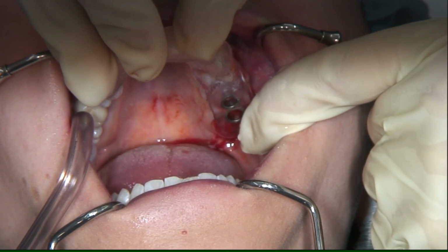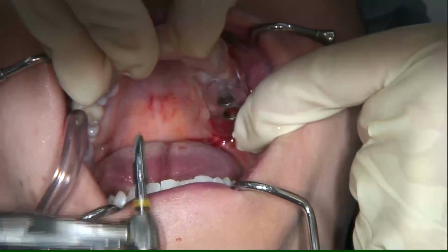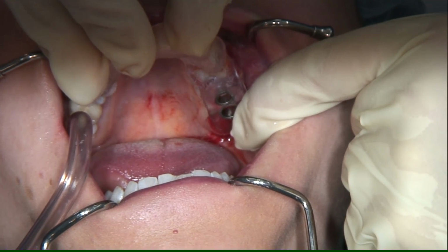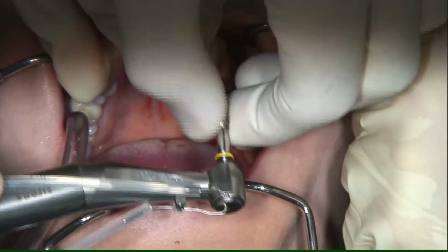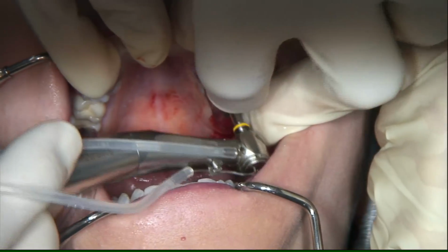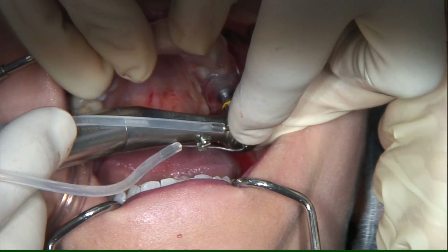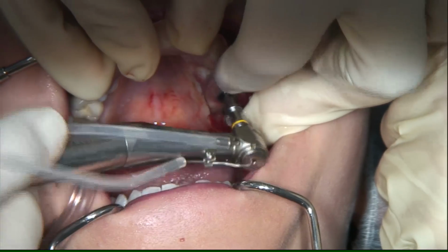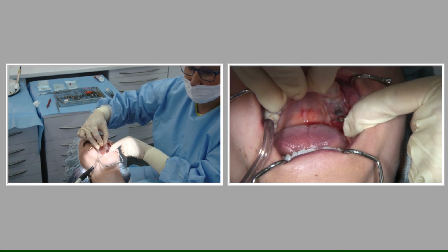You can change the drill protocol slightly intraoperatively when you see the bone density is maybe less or more. So we have 4 bone qualities from D1 to D4. And here you see the Xive Crestal twist drill for the crestal preparation.